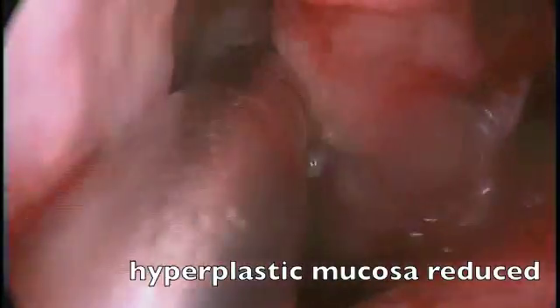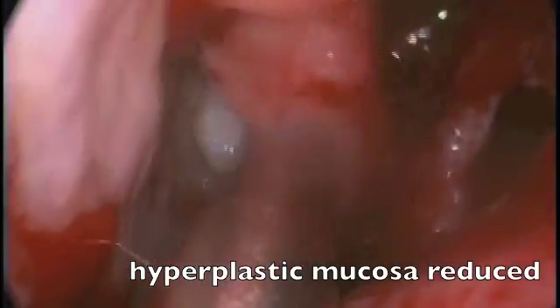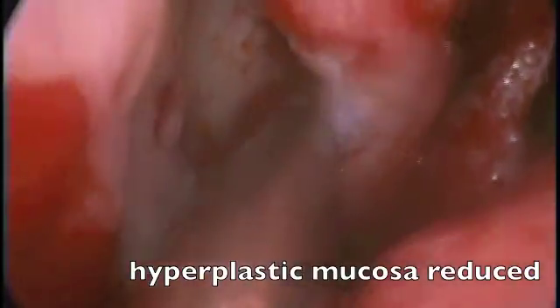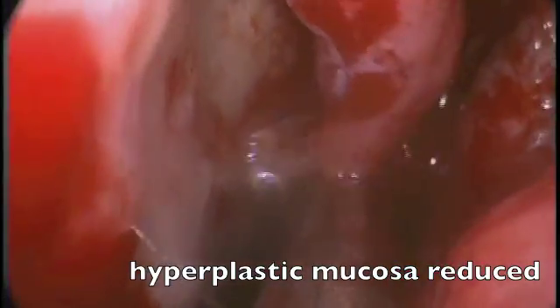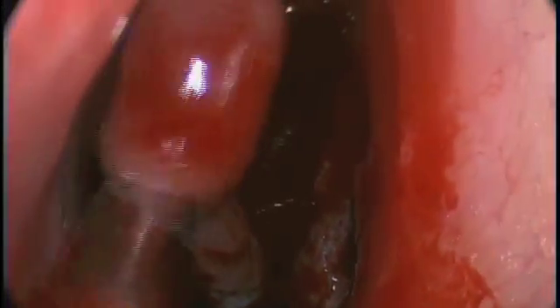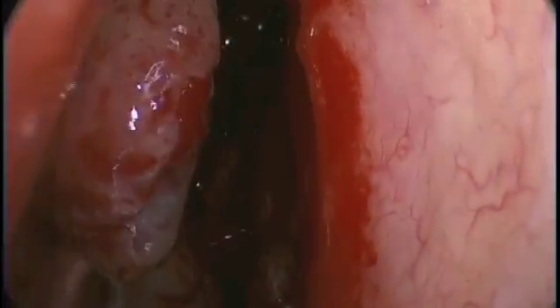Hyperplastic polypoid mucosa from the patient's remaining middle turbinate is resected with the microdebrider to allow us to essentially carve the middle turbinate into its more normal shape. This will remucosalize quite quickly and be much more normal when the patient comes off of their high-dose steroids which we have used preoperatively.